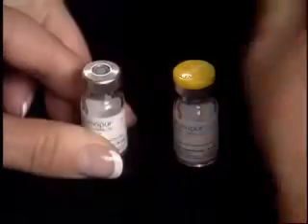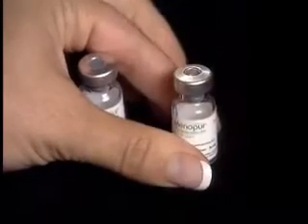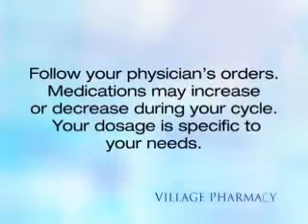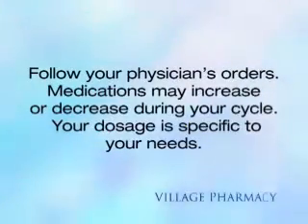Remove the plastic caps of the powdered medications that have been prescribed for you. For this example, we will mix two vials of Menopur, which equals 150 international units. Always follow your physician's orders. Medications may increase or decrease during your cycle. Your dosage is specific to your needs.